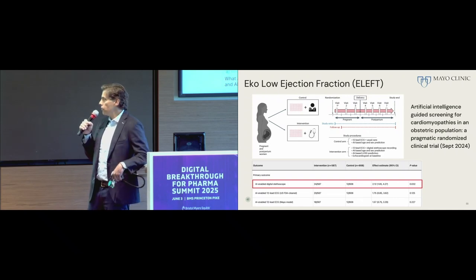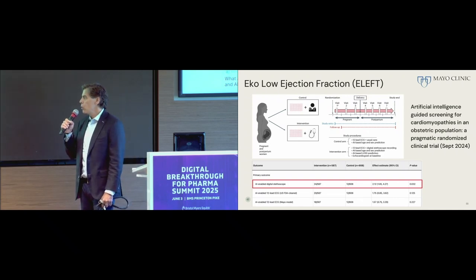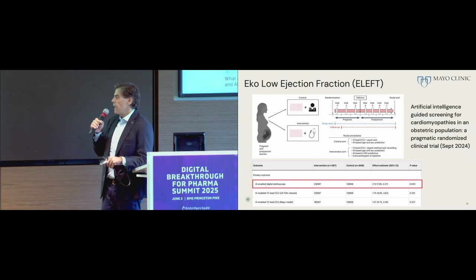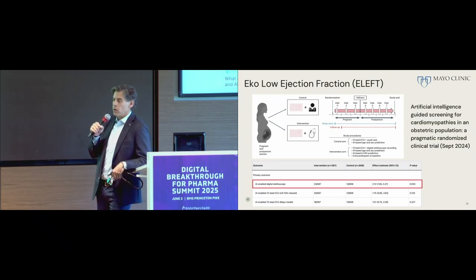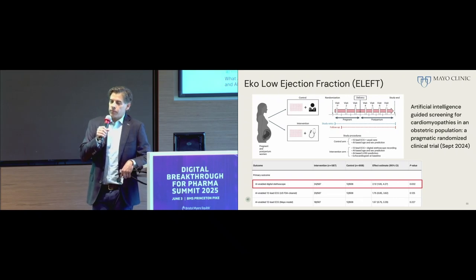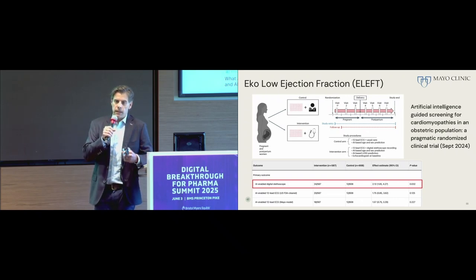And I just want to note, of the 1,000 patients or so who were examined, the stethoscope was able to detect more cardiomyopathy than both the 12-lead AI as well as standard of care in a way that was statistically significant. And so I think that the real exciting thing about this was that if you think about this location, the fact that you can provide tech like this to a community health worker in Nigeria, I think has fairly obvious implications here in the US as it relates to rural health, being able to deploy technology in the home, et cetera.